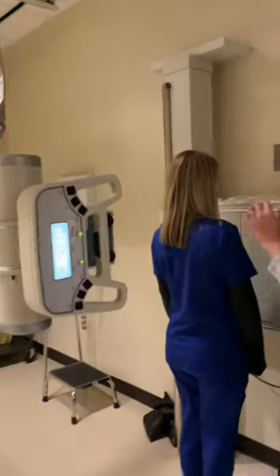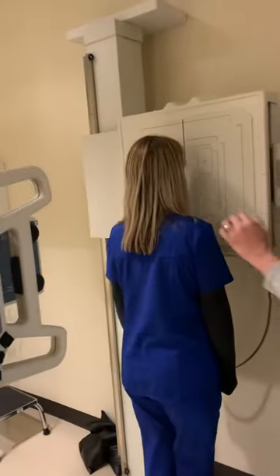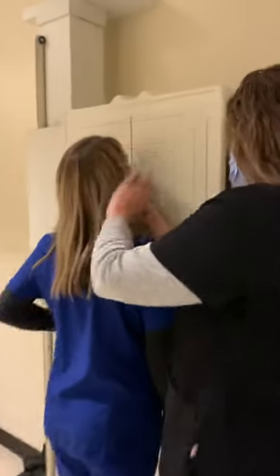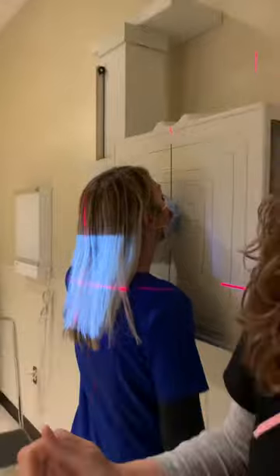Our patient is erect. This can be done prone on the table, but we are doing it upright.